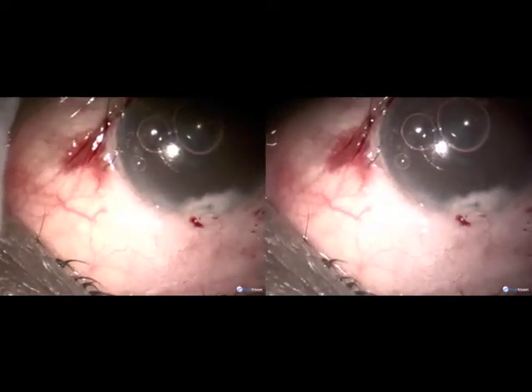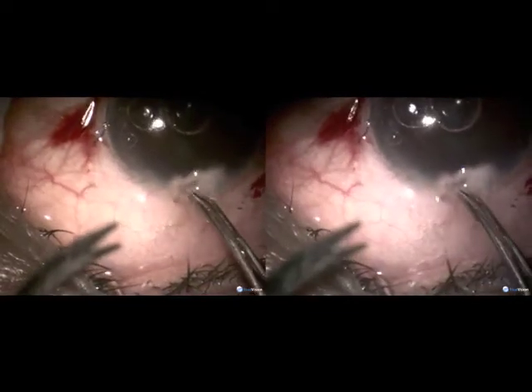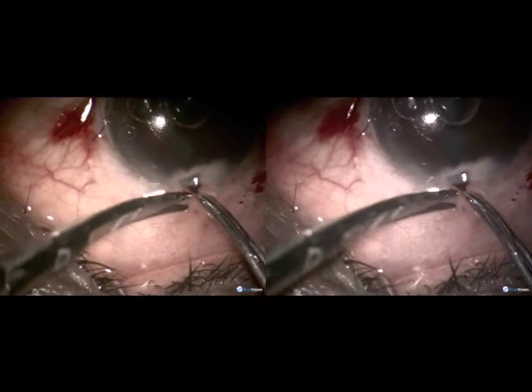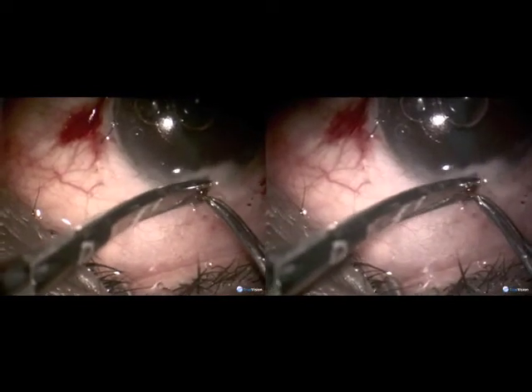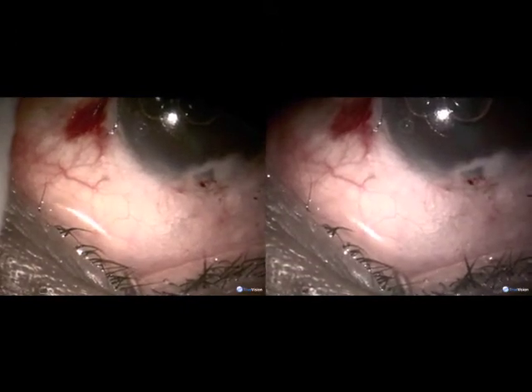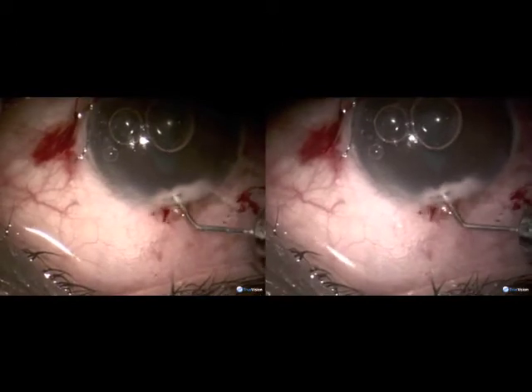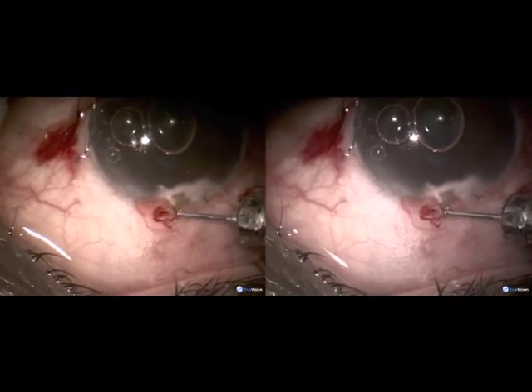A pocket incision is made into the anterior chamber, and a peripheral iridectomy is performed. This shall minimize the chances of internal closure of the tract. There is no need to apply a suture in this area.